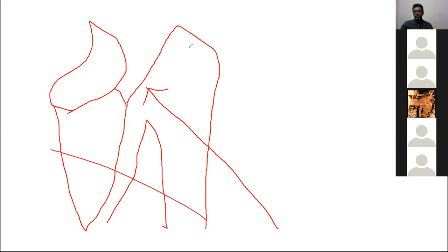When will I give an external bevel incision? When the attached gingiva is sufficient here. This is the attached gingiva. When attached gingiva is there, I can go for external bevel. Internal bevel is something like this. I am giving it coronoapically towards the alveolar crest, leaving 0.5 to 1 mm of marginal gingiva. This is the difference between external bevel and internal bevel. All the undergraduates and postgraduates need to understand this, because the external bevel incision is given apico-coronally, and the internal bevel incision, which is here, is given coronoapically.